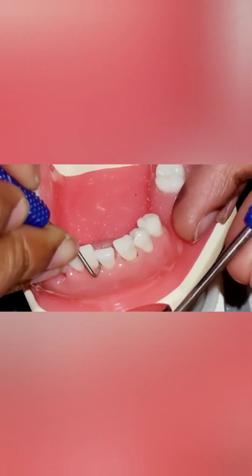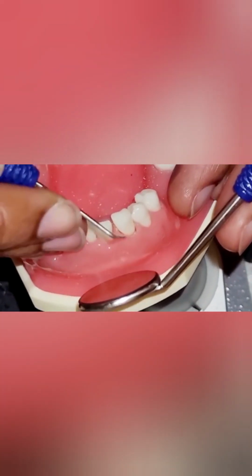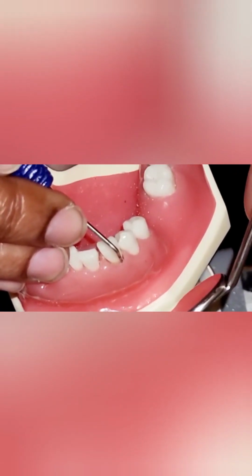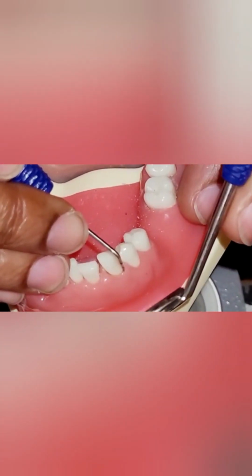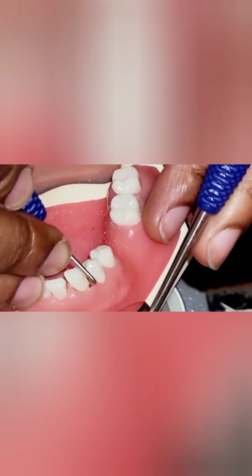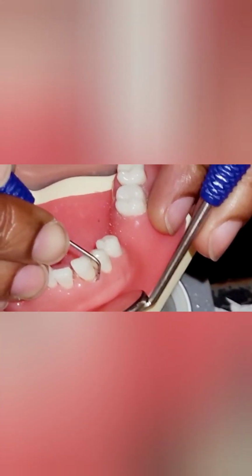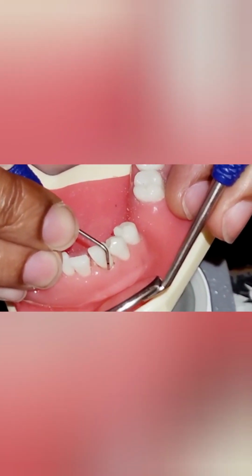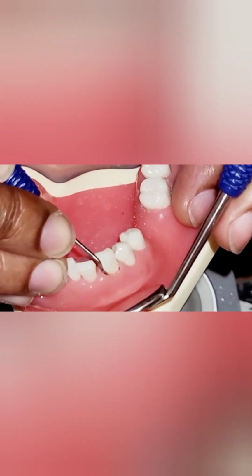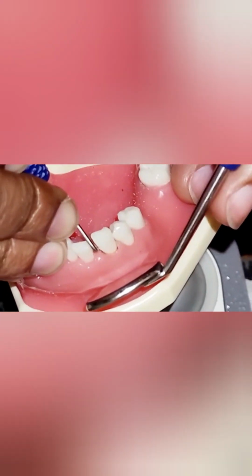Eight. 10. And our last anterior canine. We have a 9. Looks like a 7. 11.